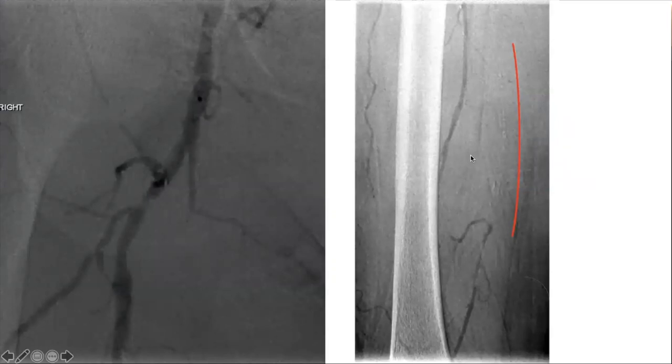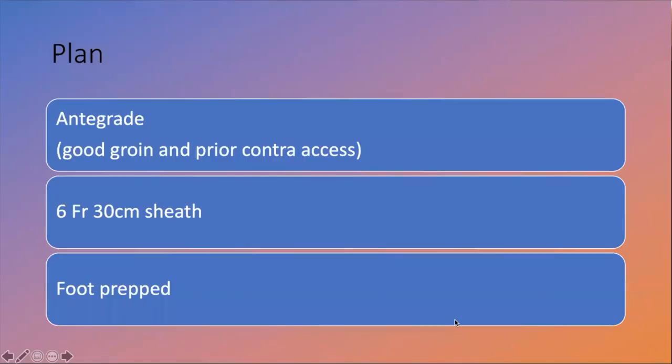You can see there's an SFA occlusion that includes all the way — there's some calcium — all the way to the distal SFA, proximal pop. This is that Hunter's canal, that high level of flexion zone. My plan, since I've already had the angiogram previously, is to go antegrade, because I have enough running room in the common femoral into the SFA. That's one thing you have to consider: if you have a flush occlusion of the SFA going down that same side, you're not going to have a lot of room to get your sheath in.